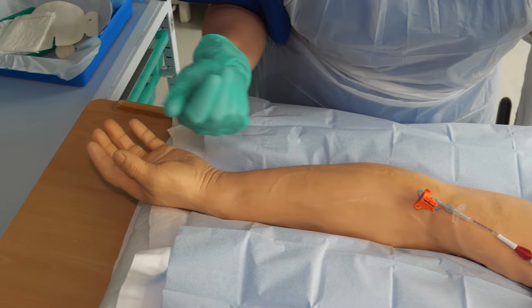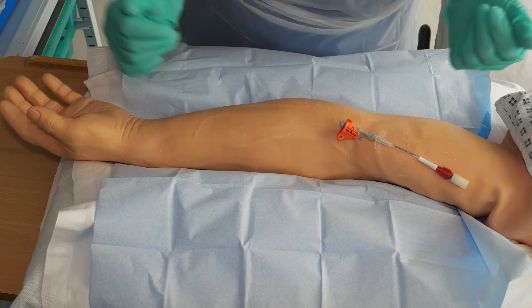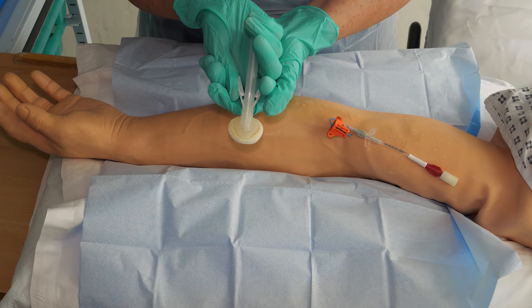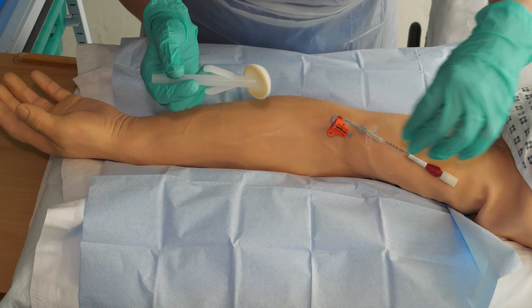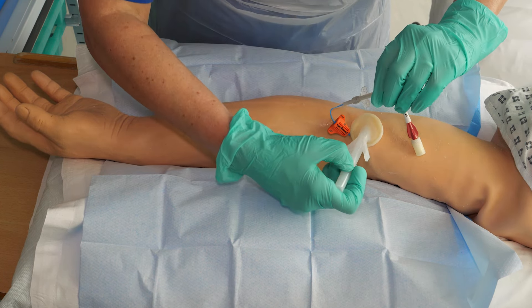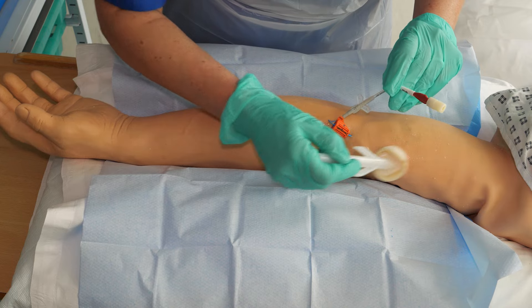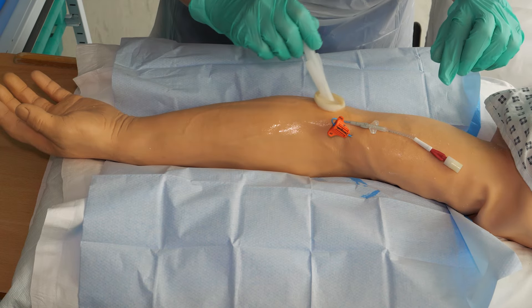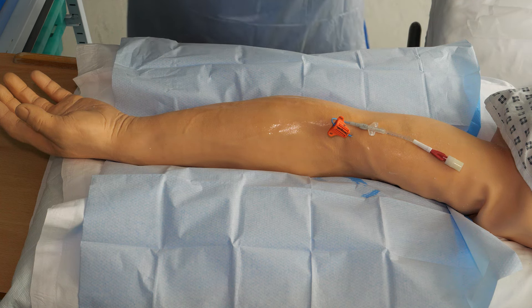The secure cath is now visible and the PICC exposed. This is securing the PICC line and remains in place — the secure cath prevents the line from moving. Using the Chloroprep sponge, squeeze the arms to release the cleaning solution. Lift the line and secure cath and clean as shown, remembering to clean under the secure cath and around the entry point. Drop the Chloroprep sponge away from the dressing tray and allow the area to air dry to avoid skin irritation.